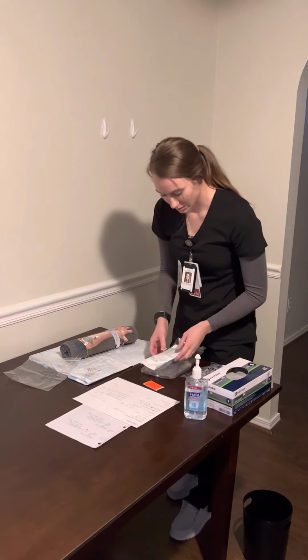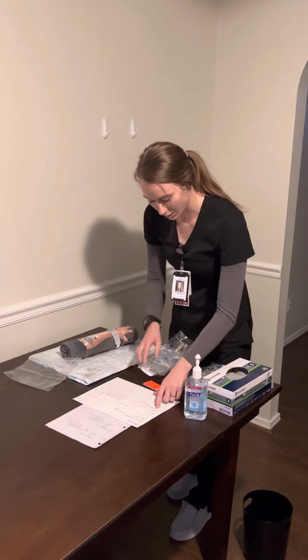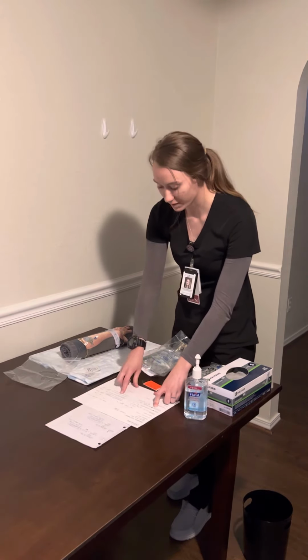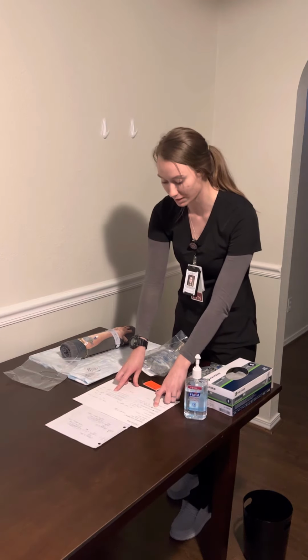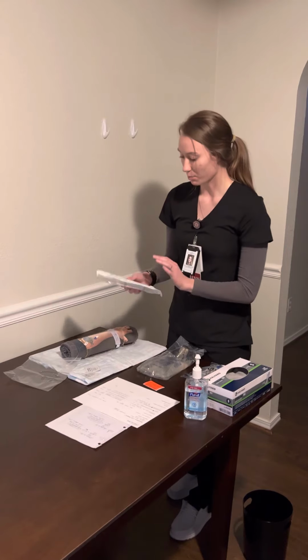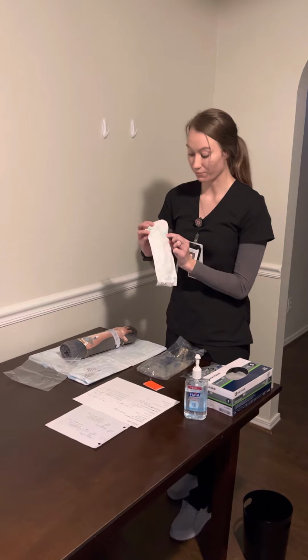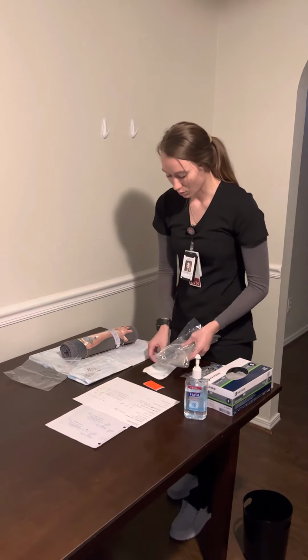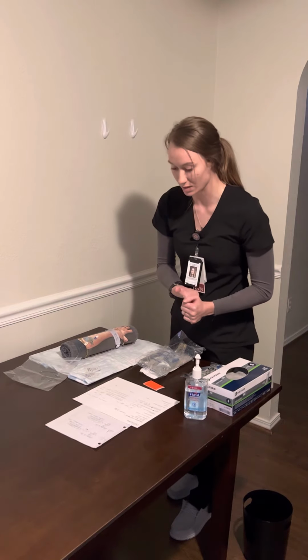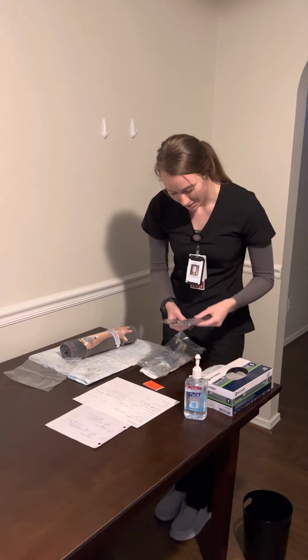So the first is sodium chloride 500 milliliters. That is to be given 125 milliliters per hour via gravity using 10 drops per milliliter tubing. That math would be 21 drops per minute, but the tubing that I got in my nursing kit came with 15 drop per milliliter tubing. So the drop factor I'll be using today to get an accurate administration is going to be 31 drops per minute.